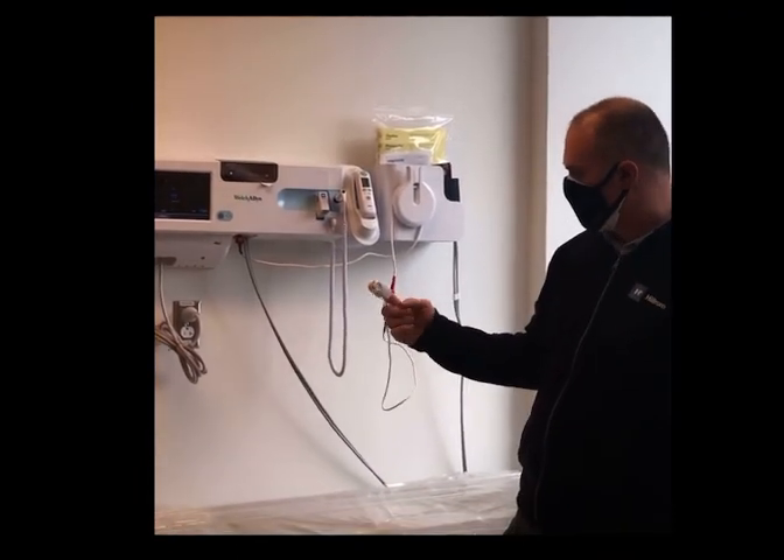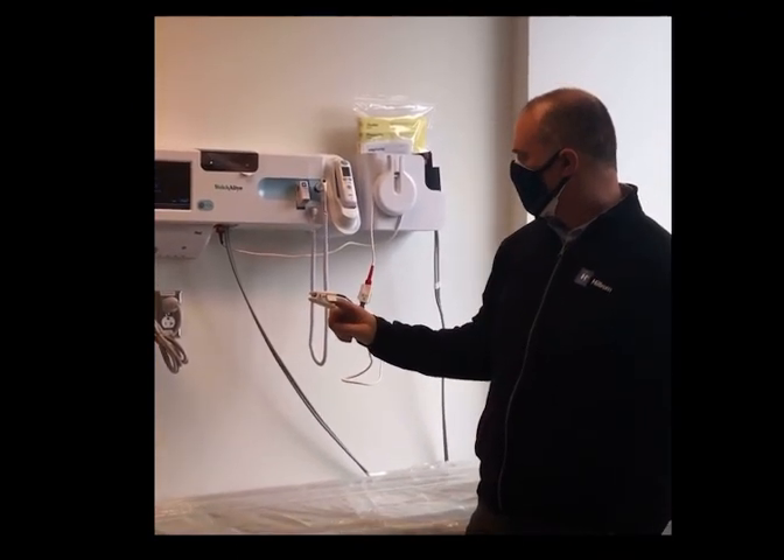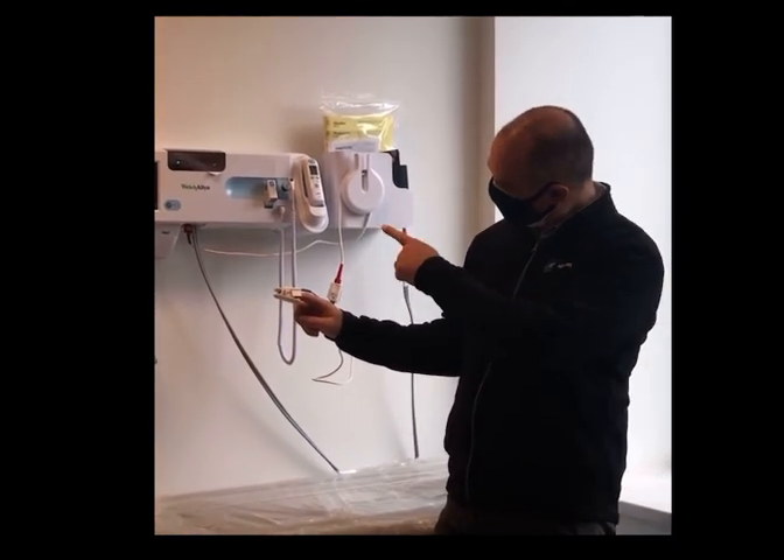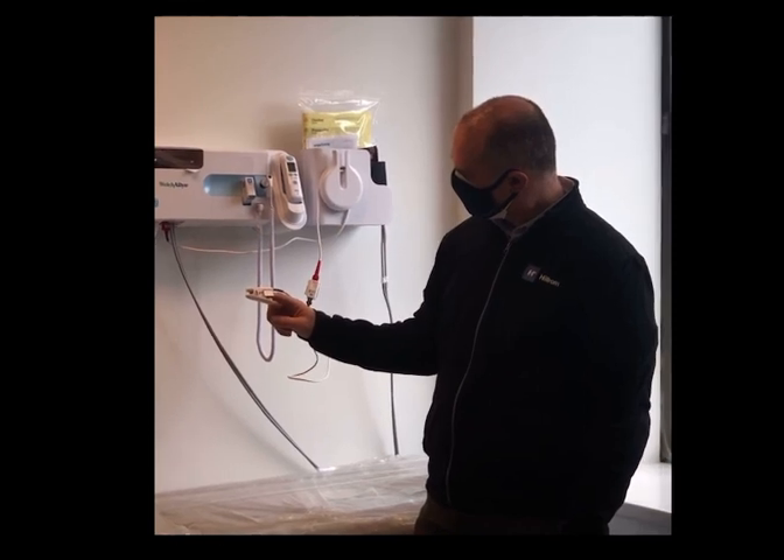O2 sensor — this is pretty self-explanatory, but this goes on to the patient's, usually their pointer finger. You'll see it starts reading after about 7 to 10 seconds.